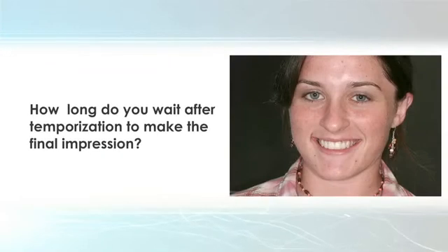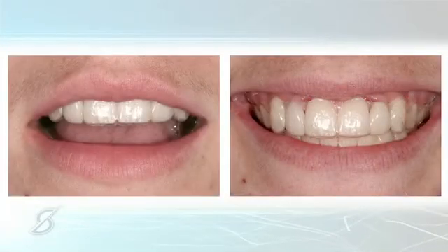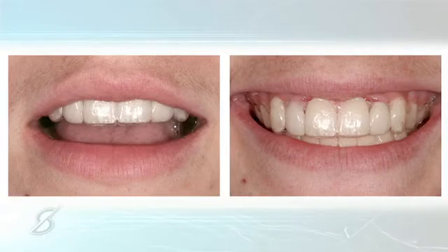So we're going to take a patient. It actually is the one you saw the video of making the impression earlier. We're going to take this patient who's had lateral incisor implants placed and connective tissue grafts over the top of them. And the tissue is not very happy because she's been wearing an Essex retainer that actually was digging into the tissue. So here she is with her Essex retainer and the two teeth inside the Essex retainer.